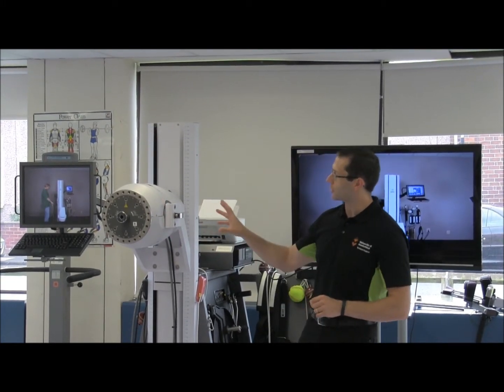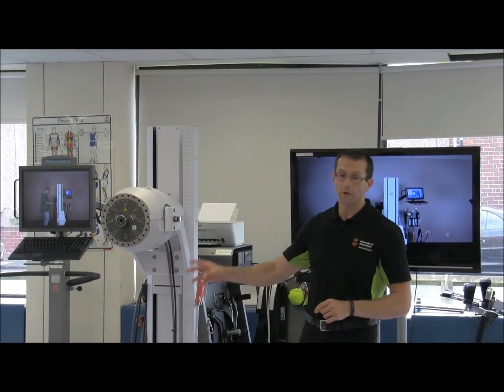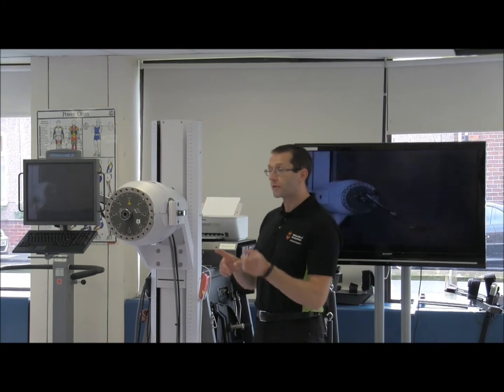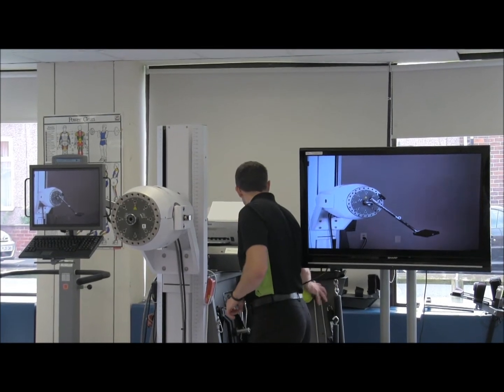We are going to do some two-dimensional movements on this, but it also has the capability to attach a cable system to it, which gives a bit more usefulness to do much more dynamic sport-related activities as well. If you've had a look around the unit, you'll see we've got things like cricket balls and softballs attached to it.